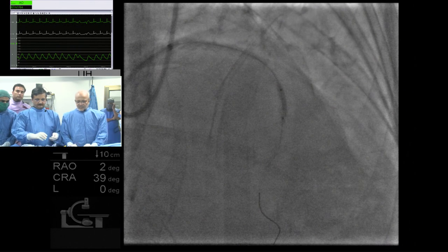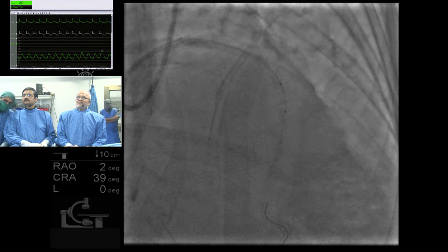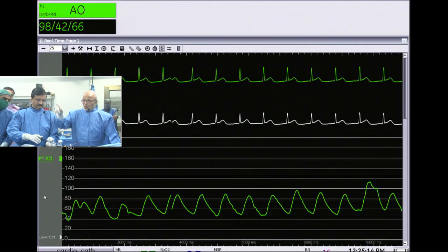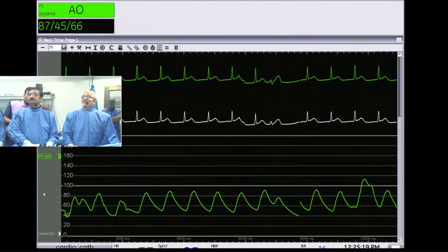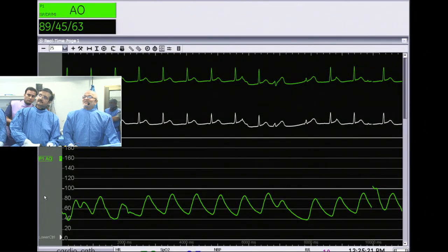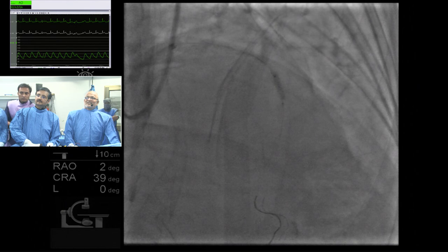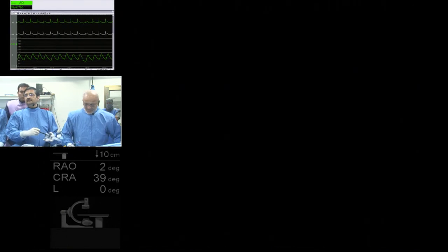Record. It's also important to show the EKG because sometimes the energy will make the heart capture. Yeah, you see the spikes there. Show the EKG once it starts. We're looking at the EKG now, and yes, you see there are four VPCs also. Done. Very nice. Six. That looks better. There, Tejas. Looks good here.